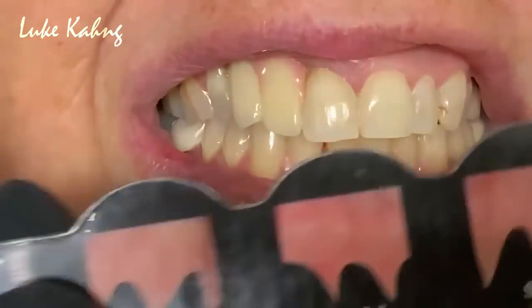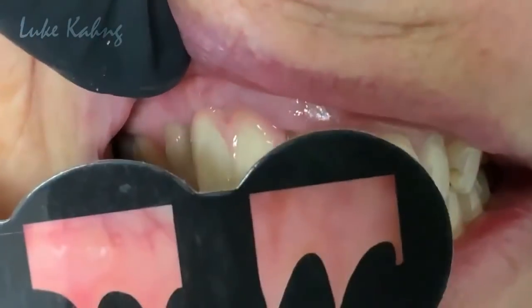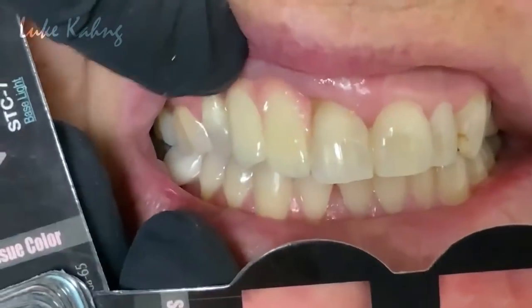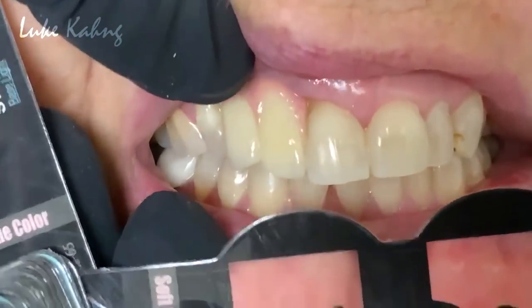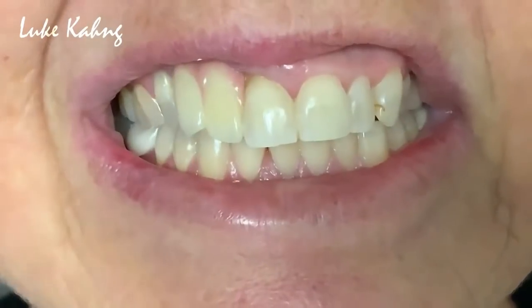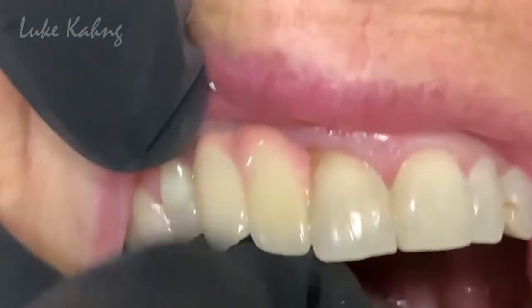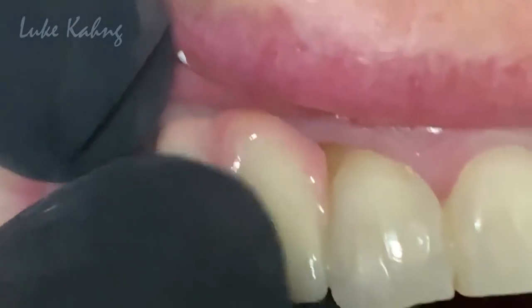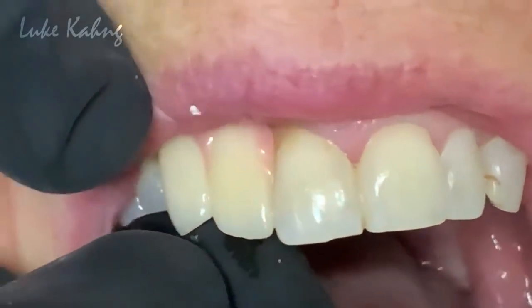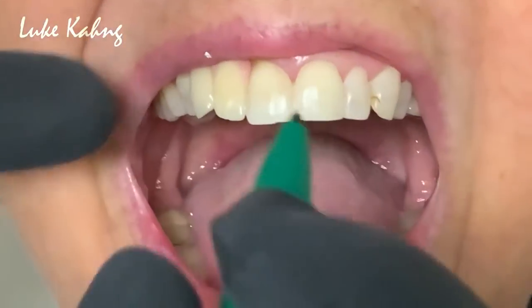Let me see the other side. There are nine total. This is a little bit better — six. I have to add with the tissue contour here and there. So I can double check with the double arch. I'm going to add here — first I'm going to trim it, and then I'm going to extend it more, like here.